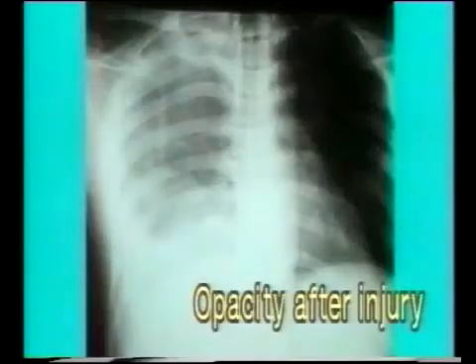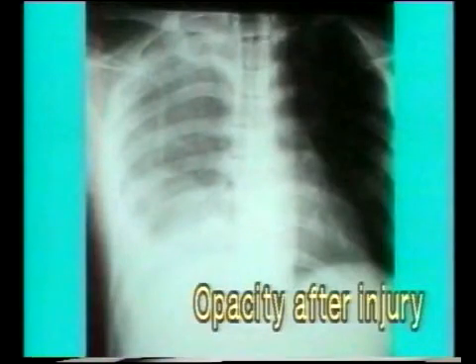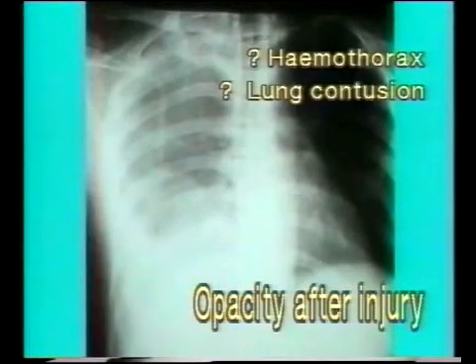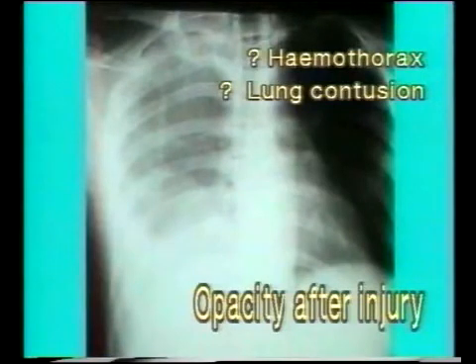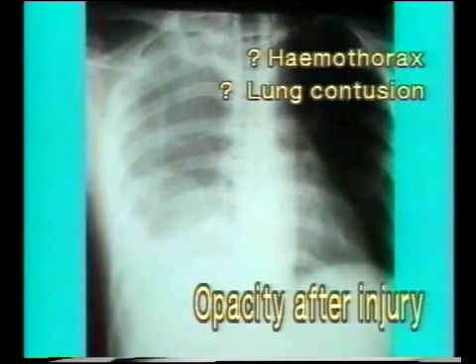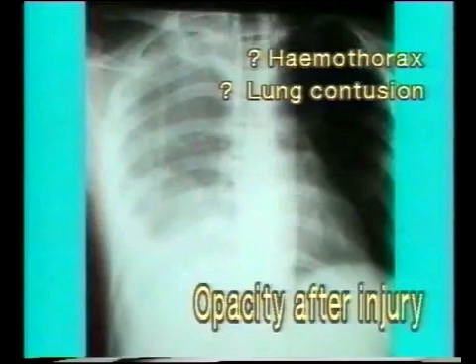This X-ray, taken in the lying-down position after a chest injury, shows opacification of the right lung with obliteration of the costophrenic angle. Either a hemothorax or a lung contusion may result in opacification of the lung. Uniform opacification of the whole side, more prominent in the costophrenic angle, suggests a hemothorax, while in the standing position this would give a shadow akin to a pleural effusion.